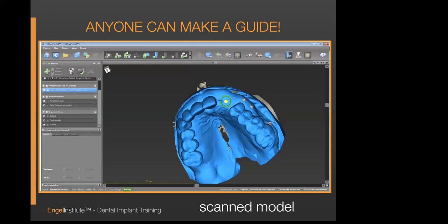Well, how does this play in right here? If it's under the canine and the canine is 7 millimeters wide, then it has to be exactly 3, or 3.5 millimeters off the contact of that bicuspid you're looking at. If I scoot 5 millimeters over or 4.5 millimeters over, then I've put an implant in a position that's not underneath the tooth, right? It's in the middle of two teeth. So my implant has to be exactly under this tooth.